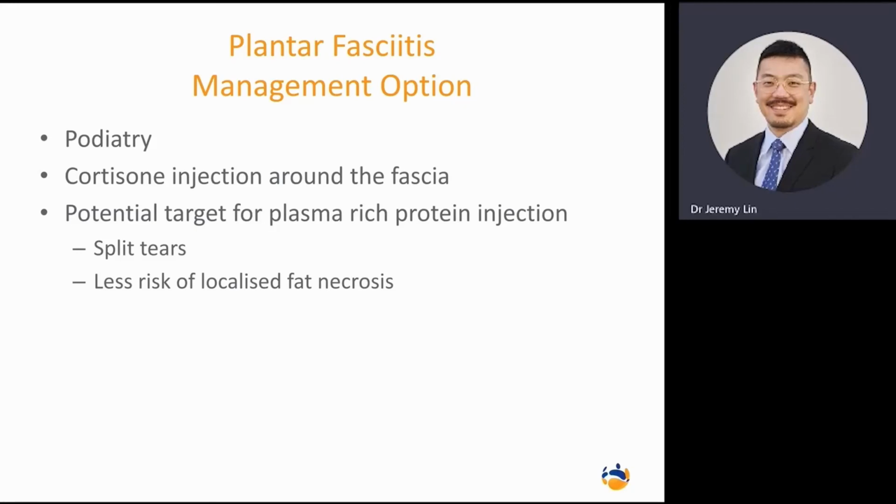And what we can often see when we bring them back for follow-up imaging is that we can start to see those areas of intrasubstance split tears become more echogenic and more linear echogenicity, indicating that we're starting to get some scarring in those split tears. So again, downside for that therapy option is that there is no Medicare rebate. Again, discussion with your patient as to benefit versus costs.